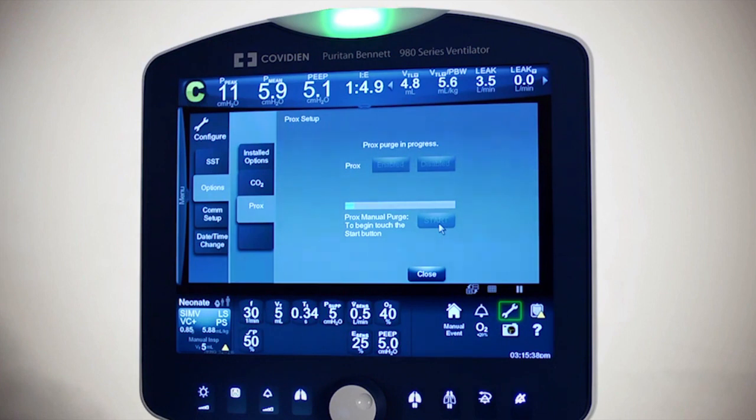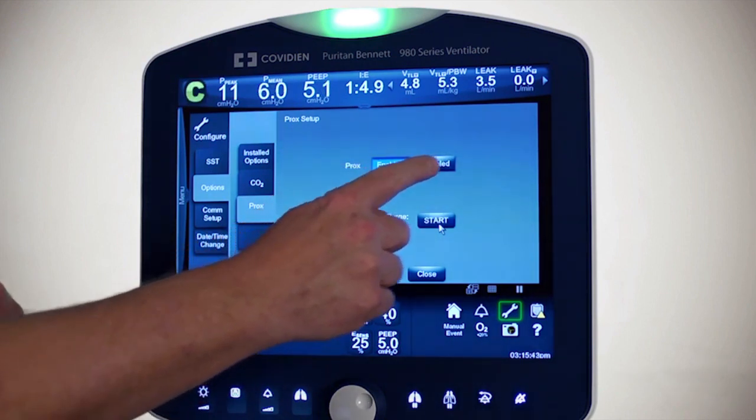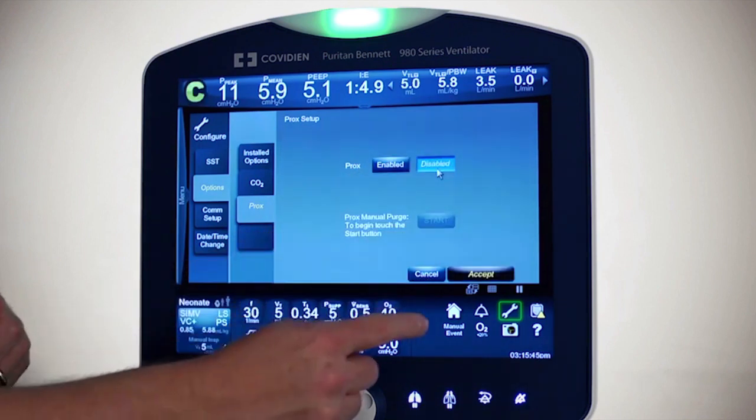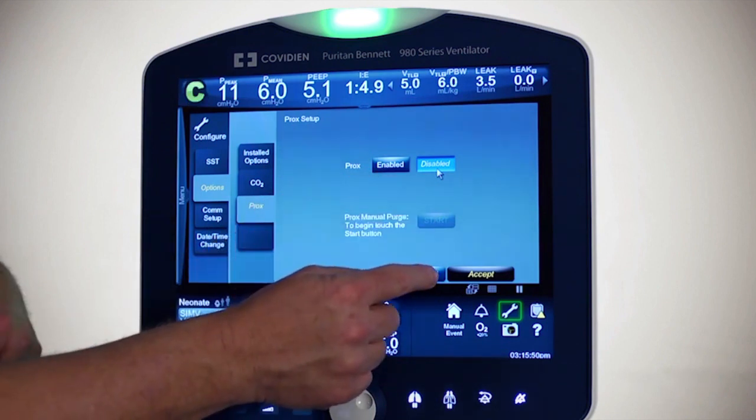The other option is you can actually turn the ProxFlow sensor off. Right up here it is enabled, but you can disable it by simply touching that and pressing accept. For right now, I'm going to leave it on, so I'll cancel out of that screen.